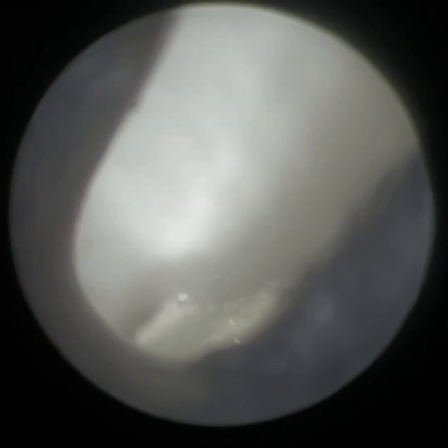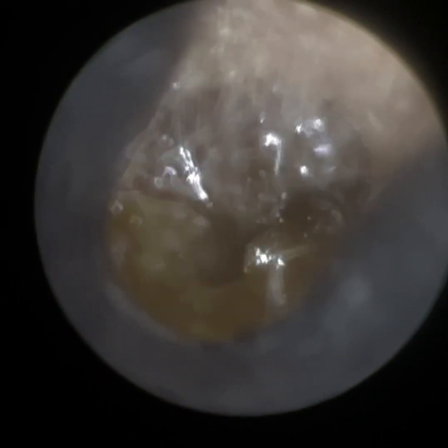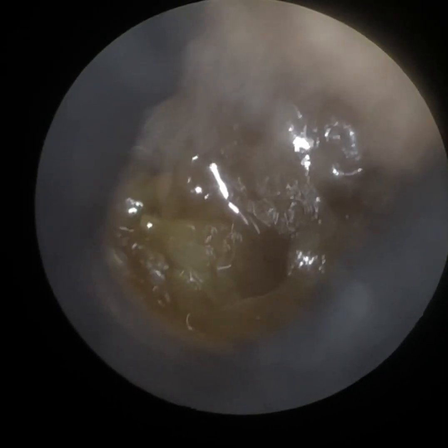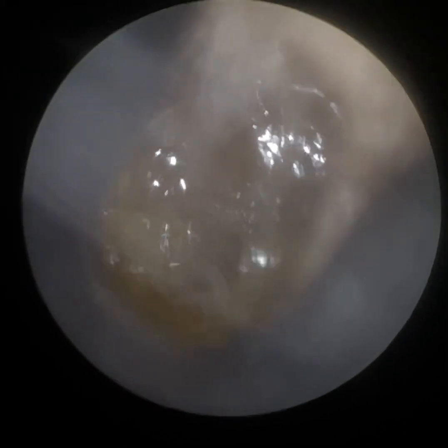So I'm just using a fine-end suction probe, managed to remove that polystyrene piece that had been lodged in the ear pretty easily and straightforwardly. Now, they also had some impacted wet wax right on the eardrum, and so this is actually on the eardrum, and this is where it just got a bit more complex because of the patient's age and they were quite fidgety.